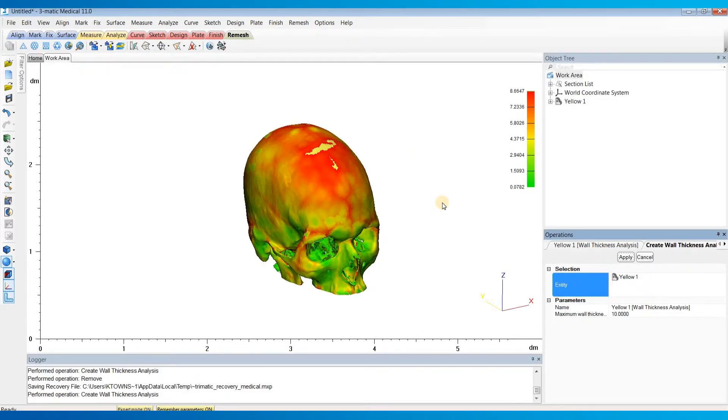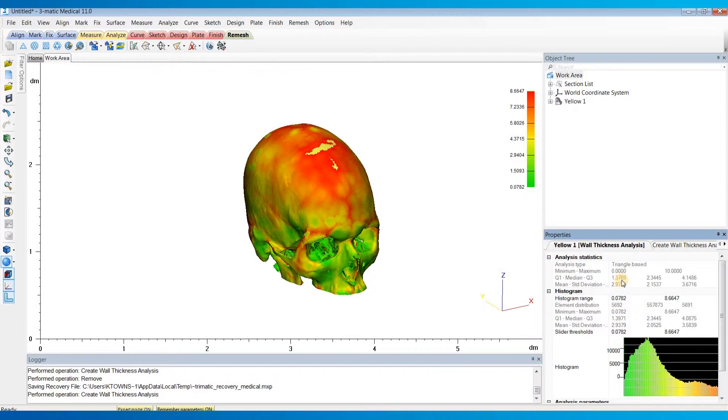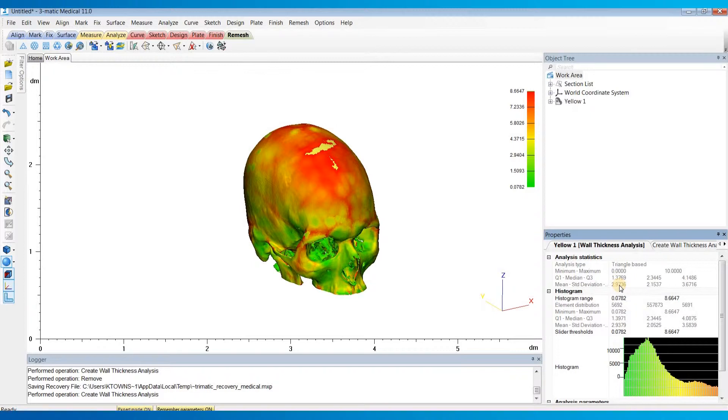So once that's done calculating, we can click here on the Properties tab to view the results. So here we have our minimum and maximum value that we set. Below that is the 25th percentile value, the median thickness value, and then the 75th percentile value. And below that is the mean or average thickness value, and this is a weighted calculation, so it takes into account the triangle sizes. Next is the standard deviation, and then lastly is the root mean squared value.